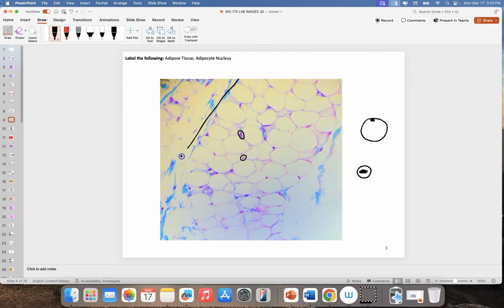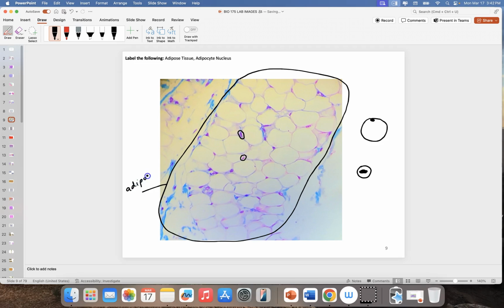All of this tissue that we can see here, I will go ahead and circle it a little bit over here also, but this is the real deal. This is really where we can see nicely that adipose tissue. And that's why I circled that section, although there's a few adipocytes hanging out over here as well. But most of it is over in this area.